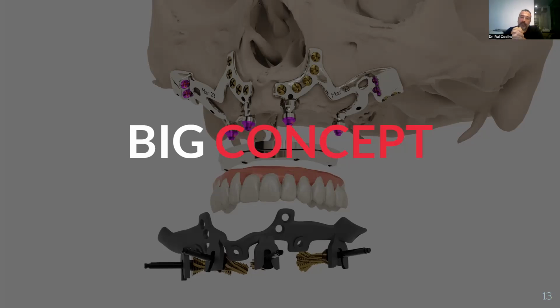Anyhow, if you have a flat crest, on buccal you will have movement of your tissue. And if you have mobility of the tissue, we know what will occur: you will have inflammation around the implant.